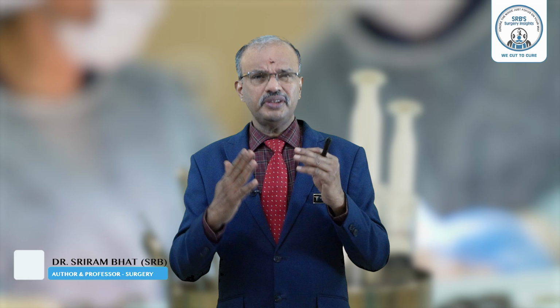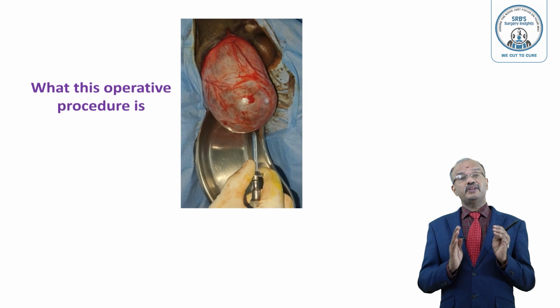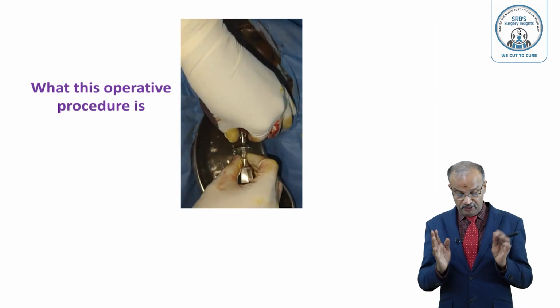Hydrocele evacuation. Dear students, I'll briefly show an operative procedure so you can enjoy it, because it's a common entity. Just see this operative procedure. See that it is a hydrocele sac. You know that the hydrocele sac is blue in color because the veins are there.